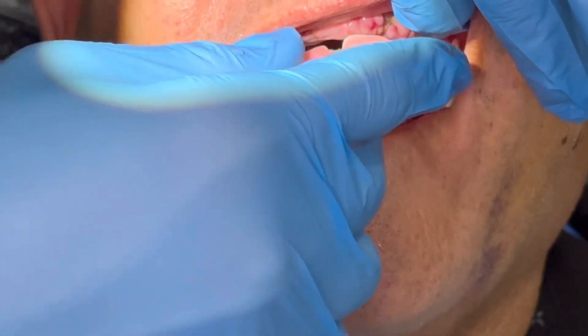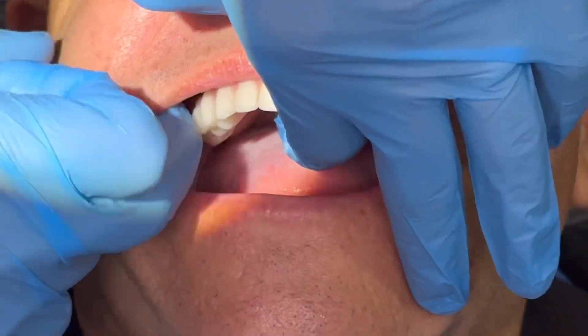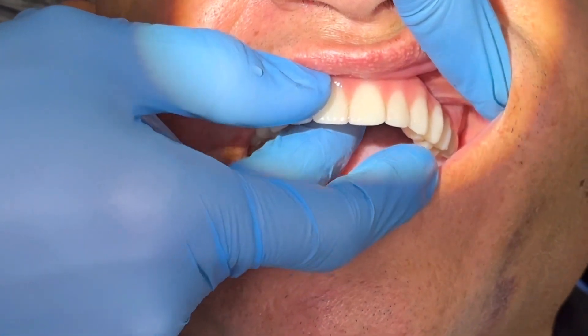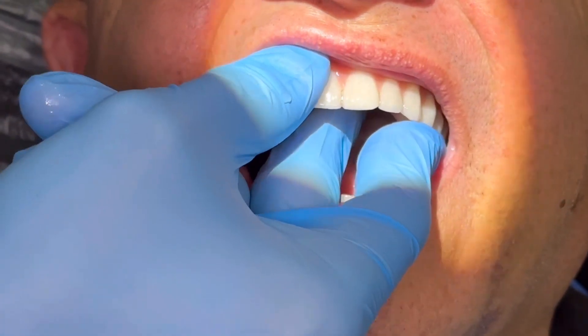We made a few little refinements today to get the patient more comfortable. Here I'm just showing the great adaptation of the borders. This is actually a milled prosthetic.